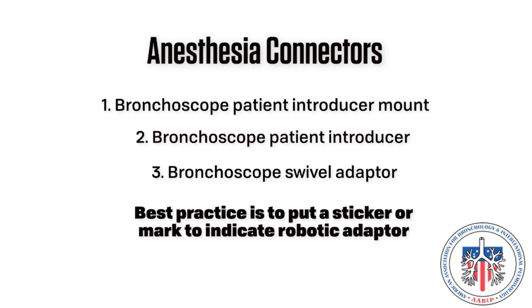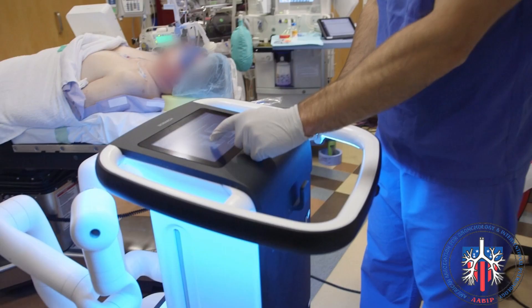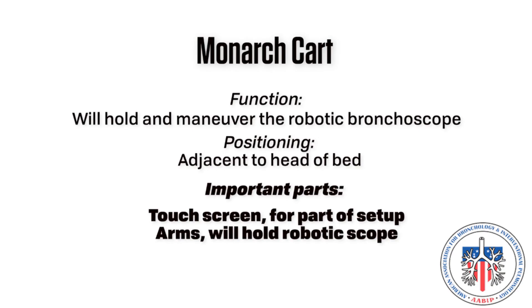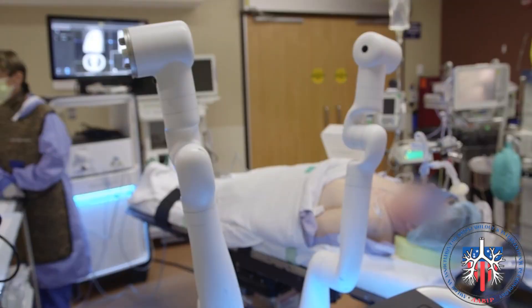Monarch cart. The Monarch cart will hold the robotic bronchoscope. Positioning: the cart should be positioned at the head of the bed. Important parts include the touch screen, which will be used for a portion of the setup; the arms, which will hold the robotic bronchoscope and sheath; and the plug for the umbilical cable.